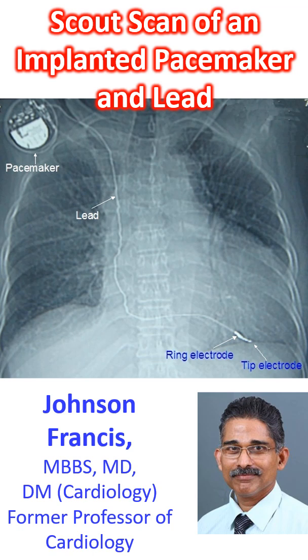The image shows an implanted pacemaker and lead very well, unlike in a conventional radiograph. The pacemaker is seen in the right pectoral region — a single chamber device used for ventricular pacing. The lead enters the subclavian vein and tracks down through the superior vena cava into the right atrium, and across the tricuspid valve, more or less in the midline, into the right ventricle.